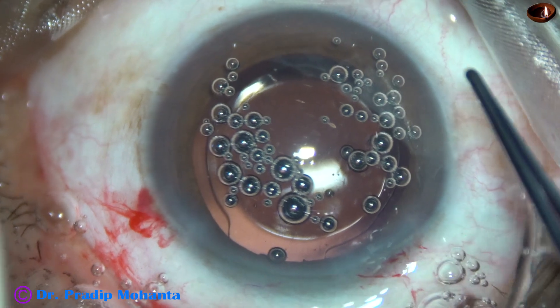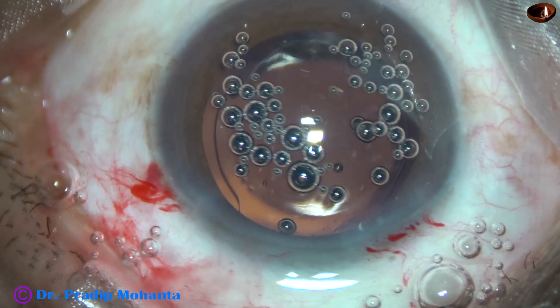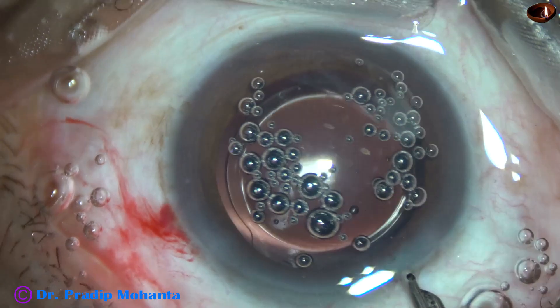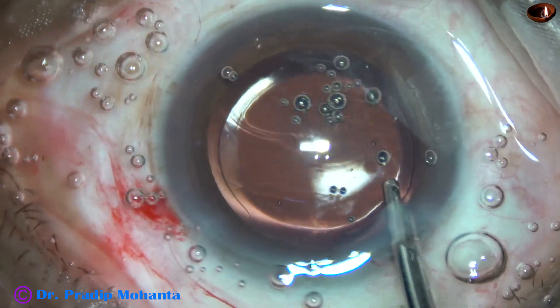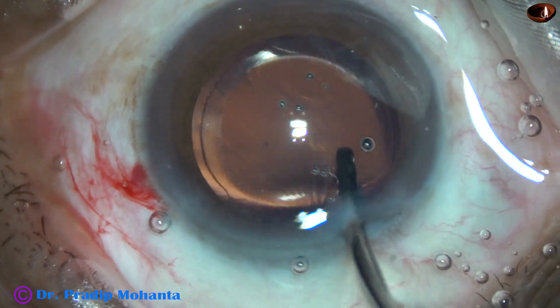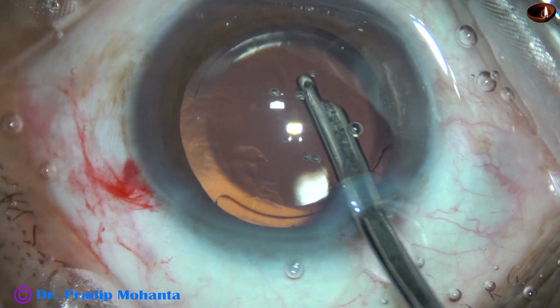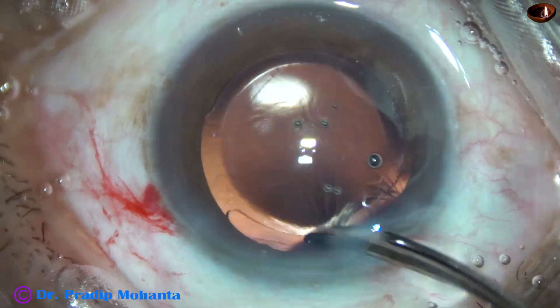There was a cotton fiber, and it was removed. Since we have used visco before implanting the intraocular lens, we have to clean the visco very nicely. We can do hydro-implantation — then it is a different thing — but once we use visco to implant the intraocular lens, we must remove the visco very nicely. There should not be any rise of intraocular pressure because of retained visco.